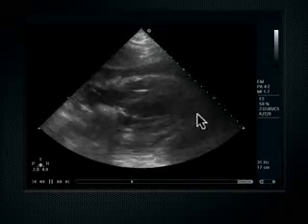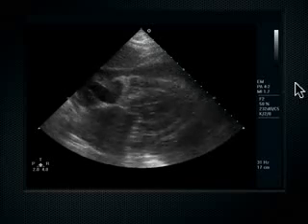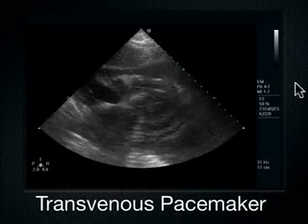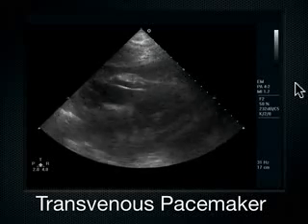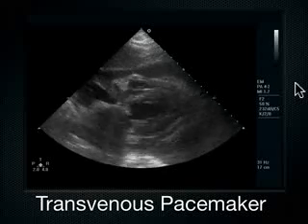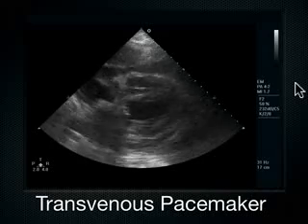I wish I had the earlier part of this clip where the guide wire was coming in and then all of a sudden it started to capture, but nobody recorded that part of it. So that's what a transvenous pacemaker looks like. It's just something to consider if you're in the heat of the battle and you're trying to float this transvenous pacemaker somewhere wherever you are. Think about looking at it under ultrasound guidance so you can turn it and guide it to get it in that spot. Those pacing wires make very good reflectors of ultrasound.